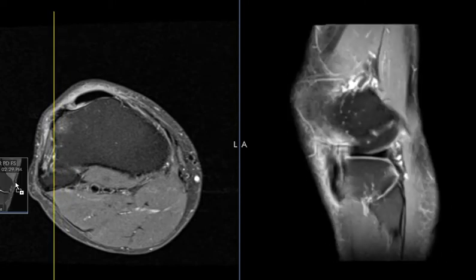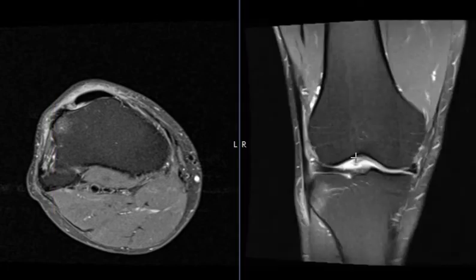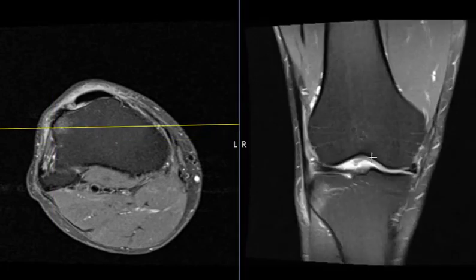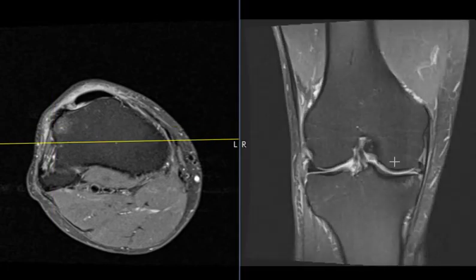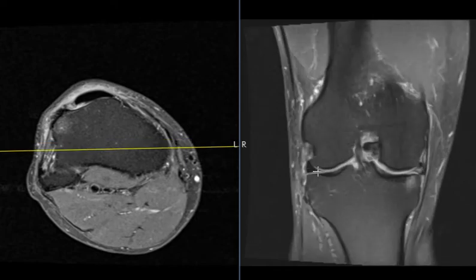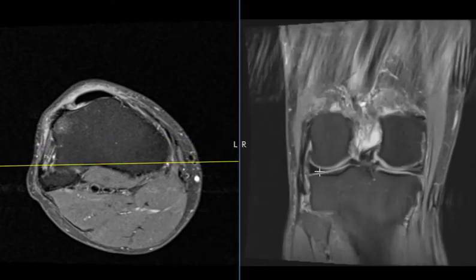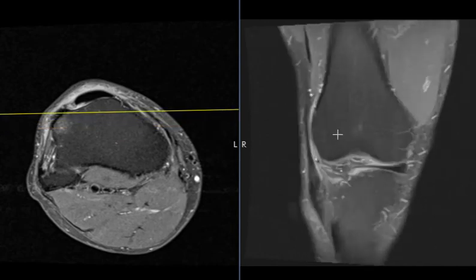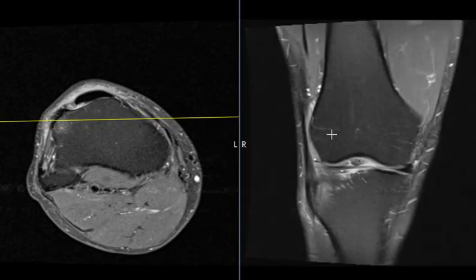Also, we have another view of the same thing. If we look on this coronal view, there's a view straight ahead where we can see the femur up top, tibia down below. We see the meniscus out here — the lateral meniscus. And if we go more forward we see abnormal signal between the femur here laterally.